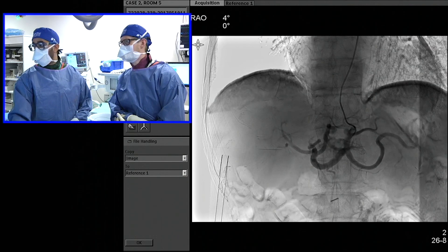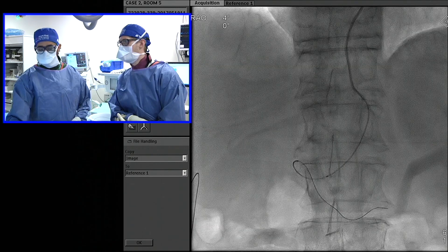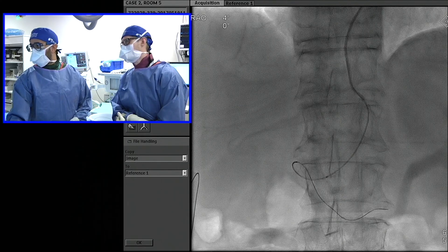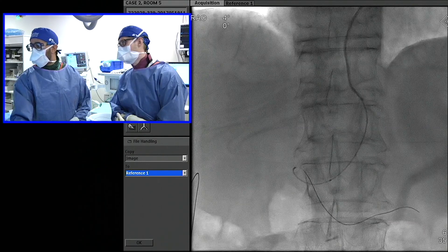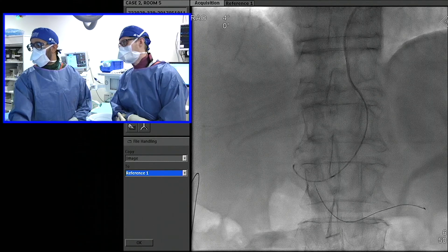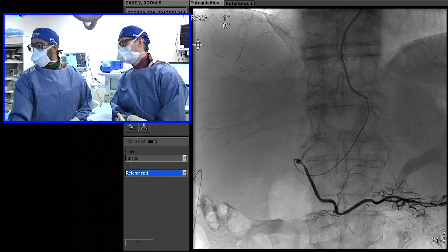The first thing we're going to do is actually take the right gastric. I think that's going to be pretty close — if we end up having to treat segment four or treat the left, we may have an issue. We were able to catheterize this; it took a little work. We have a long wire here — Boston Scientific just came out with their 215-centimeter-length Fathom — so that's what we're using here in a blue Progreat, a high-flow Progreat. We're in the right gastric now, and we're going to go ahead and embolize it.